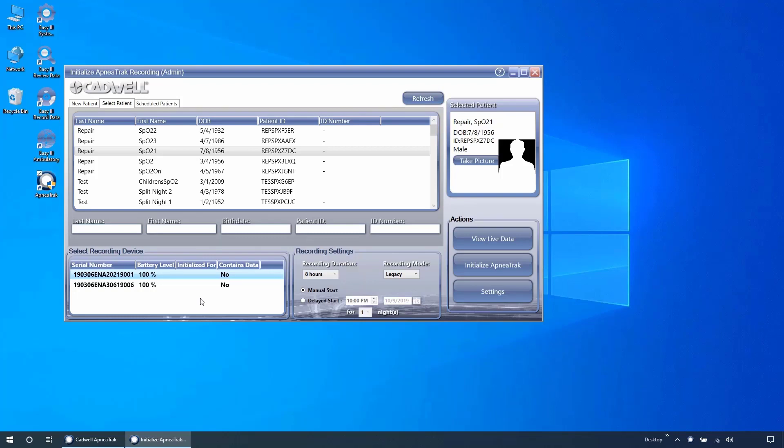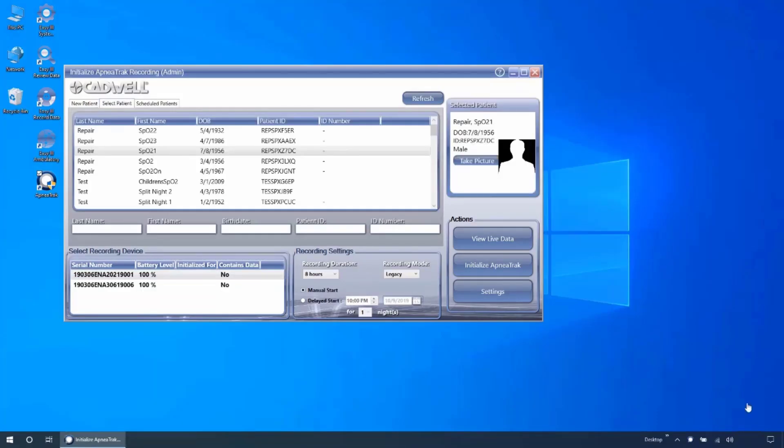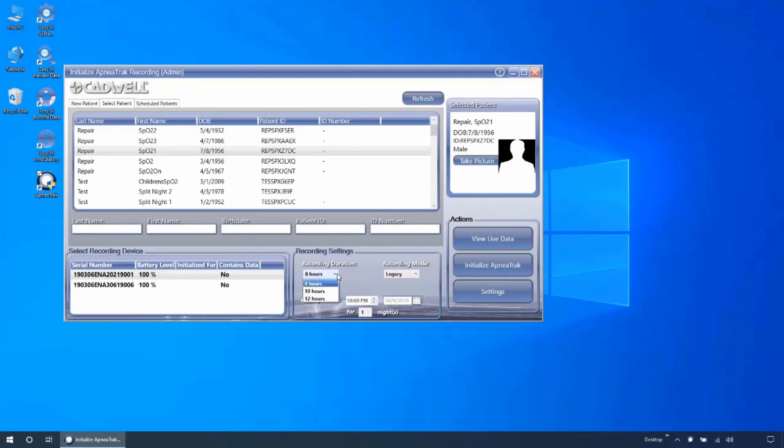The anatomical LEDs will illuminate on the device when it is selected from the list. Once you have selected a device, you can use the recording settings section to configure the device. First, select the duration of the recording. This can be set to record for 8, 10, or 12 hours. The default can be configured in the ApneaTrak settings menu.